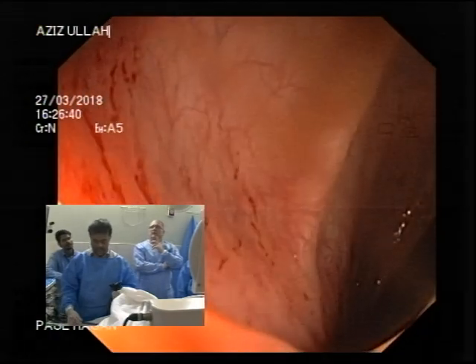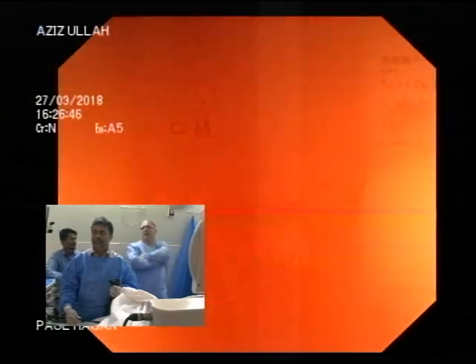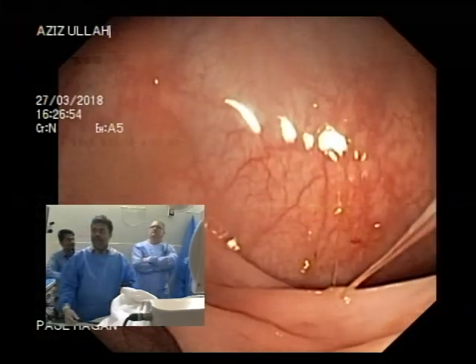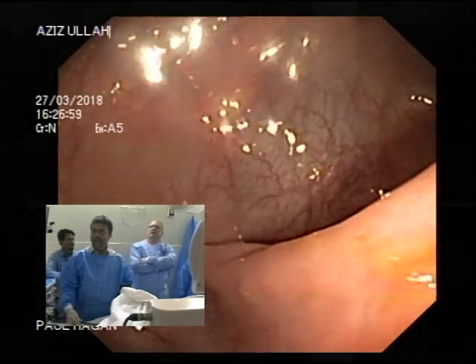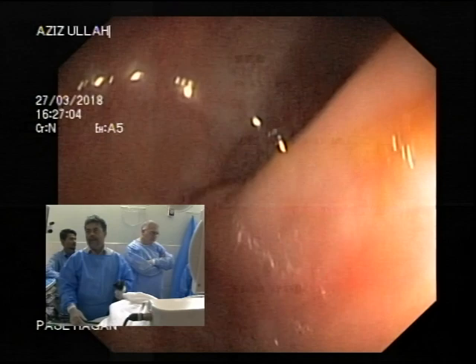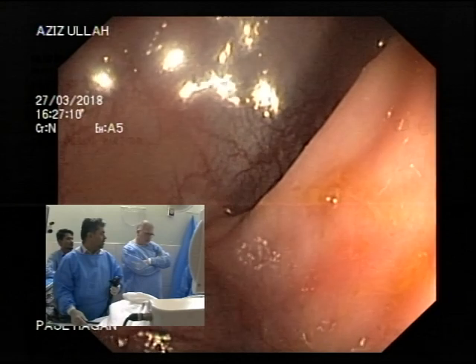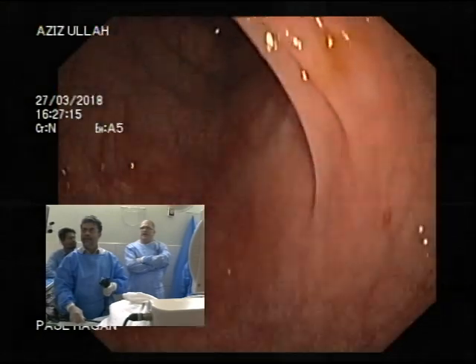Keep coming. Keep coming. That's caused by a bit of stress on the scope. Okay, so now you could consider retroverting. What are you going to do first? What are you going to do when you're going to do the retroversion? So that's aphthous from the prep.